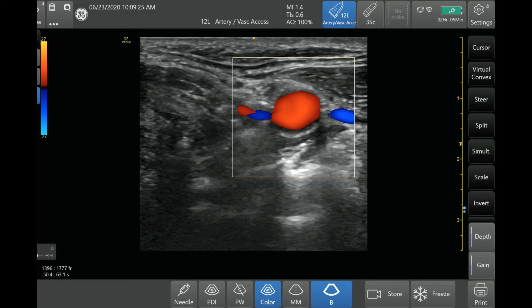Those are the main settings for color Doppler. Just go through it in that order each time: push the color Doppler button, then adjust your box — move it around and adjust the size so that it's only scanning the area of interest. Next, adjust your scale to the appropriate level for your velocities depending on which application you're using. And lastly, adjust the gain to make sure that the color Doppler is properly gained.